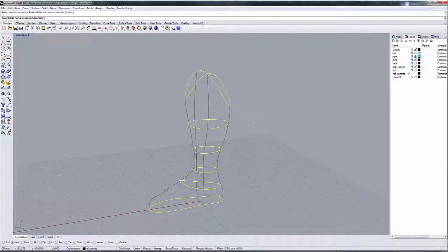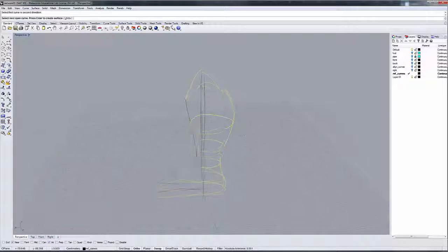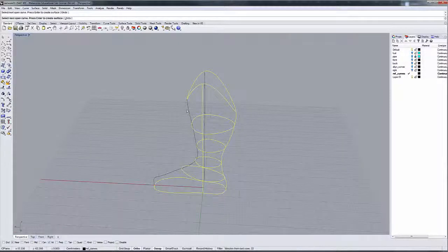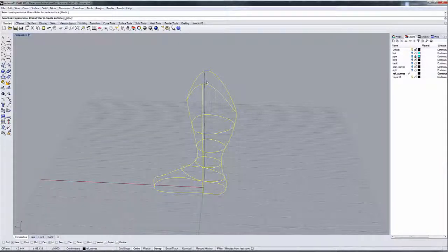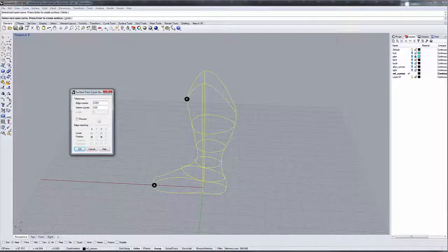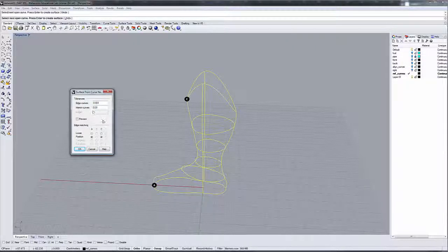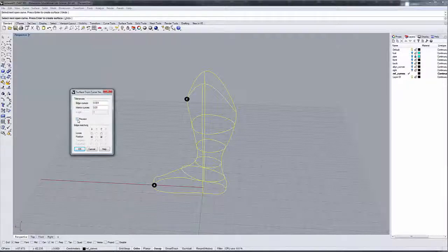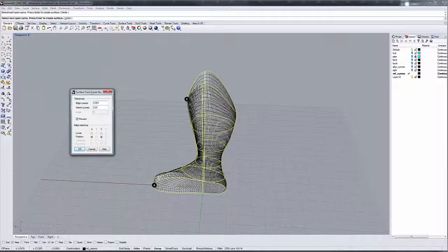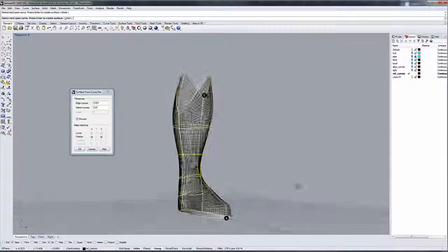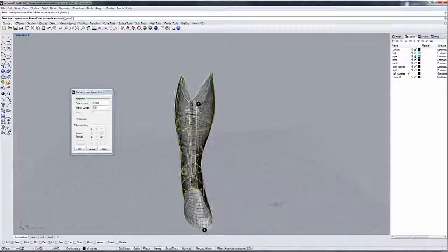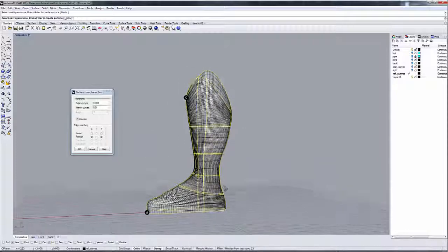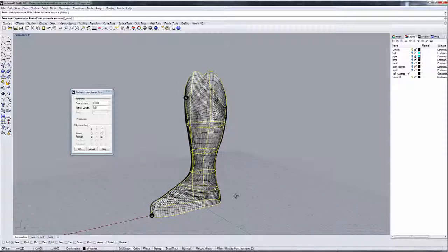Now I'm going to right click, and then it says select first curve in the second direction. We're going to go here, here, here, and there, and then I'm going to right click. And we've got a good network because this window has come up, and we can turn on preview. This will give us an image of what our curve will look like.